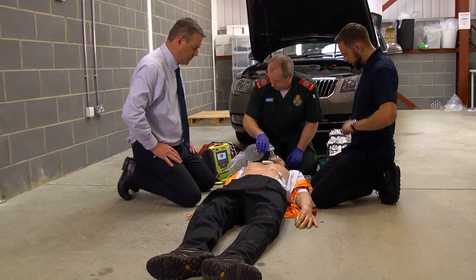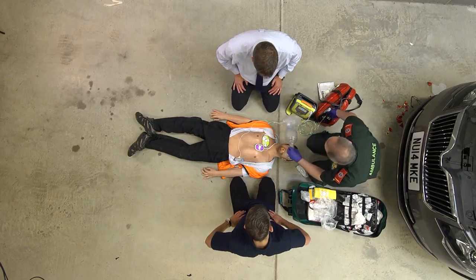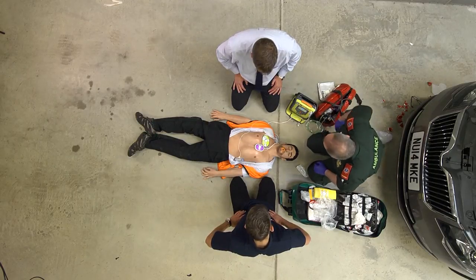Stop CPR. Don't touch the patient. Analyzing. Don't touch the patient. Analyzing. Shock advised. Don't touch the patient.